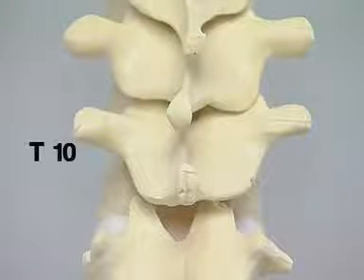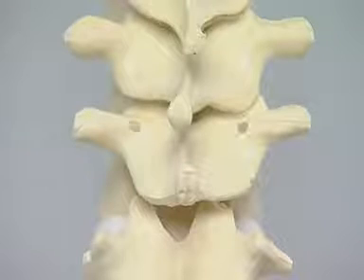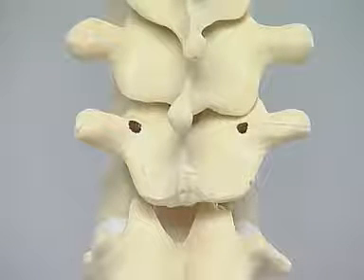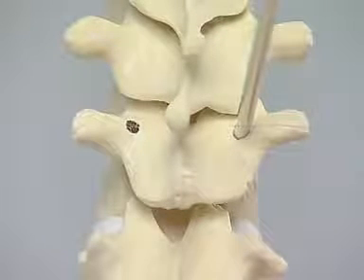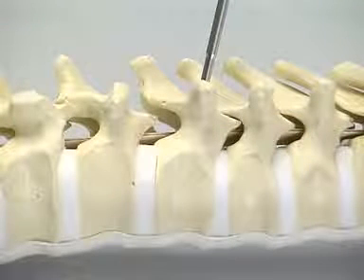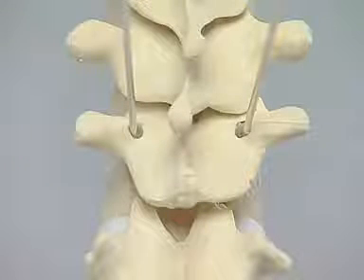Use T10 as a typical thoracic vertebra. Identify and mark the surface projection of the pedicle, and use the pedicle awl and pedicle probe to prepare the screw track. The caudal angulation can be seen, and the K-wires demonstrate less than ten degrees convergence towards the midline.